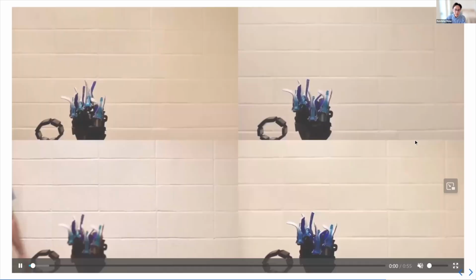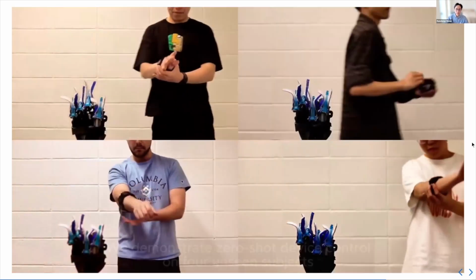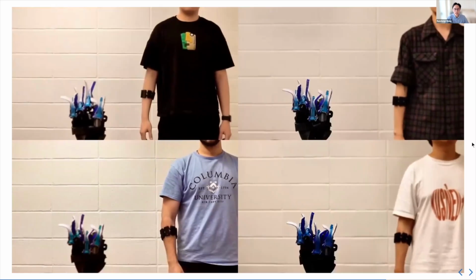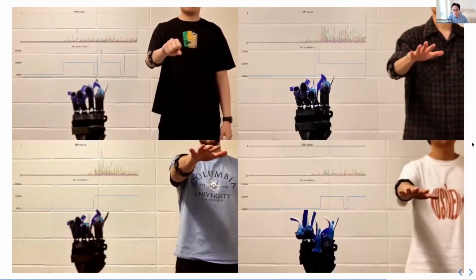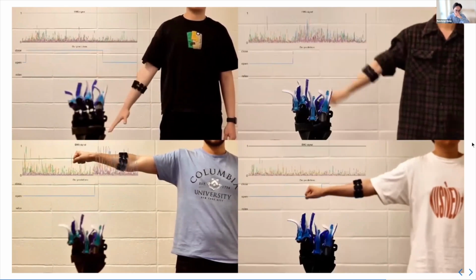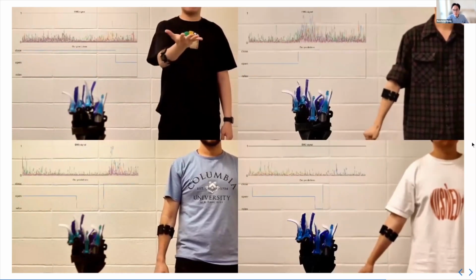And what this looks like in practice is shown here. In this video, you have 4 unseen subjects, not part of the training set, and they're asked to try opening and closing gestures to control this hand orthosis right here. You can see the signal and the predictions on the top left of each video. And we're showing you that in different postures, this model works.